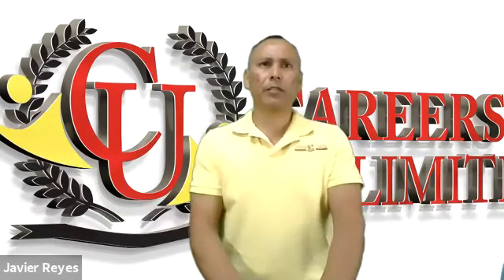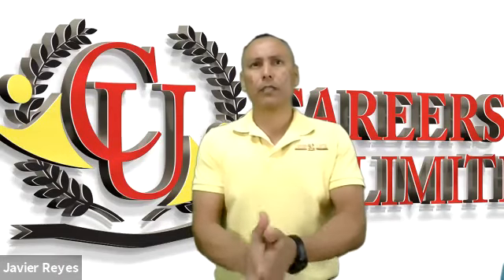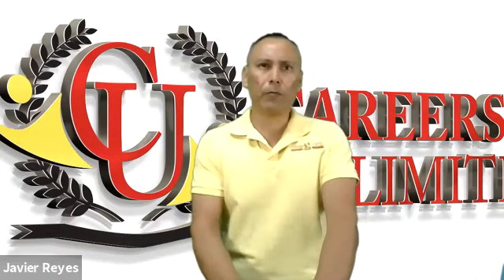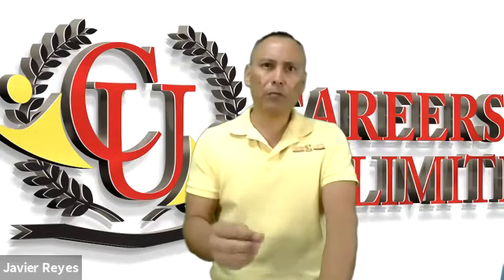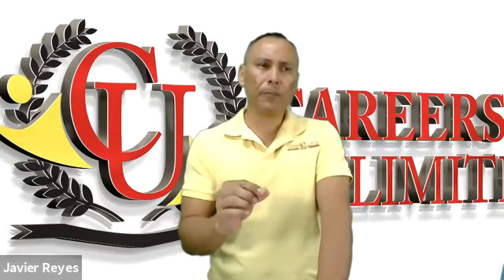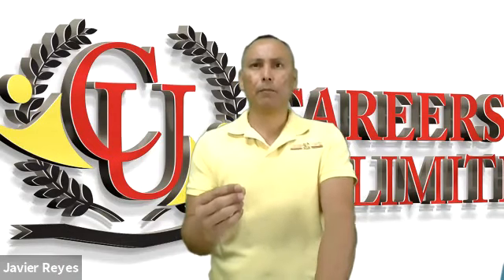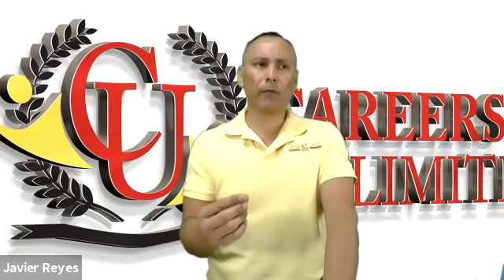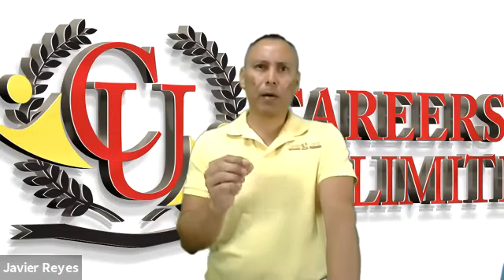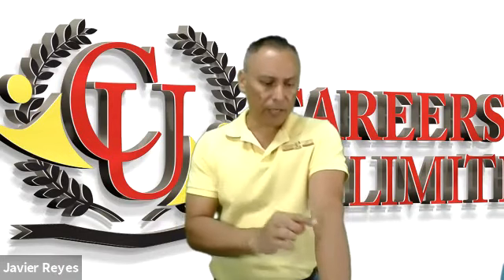Now, other problem areas you may encounter are damaged veins. Damaged veins are those veins that are sclerosed or hardened. How do those feel? When you palpate a vein, remember we're looking for a bouncy sensation. We want to make sure that that vein is nice and bouncy and that it's filled with fluid or blood. We don't want to try to collect a specimen from a vein that is hard. So don't get confused. Always look for that bouncy sensation when you're palpating for the veins, right?